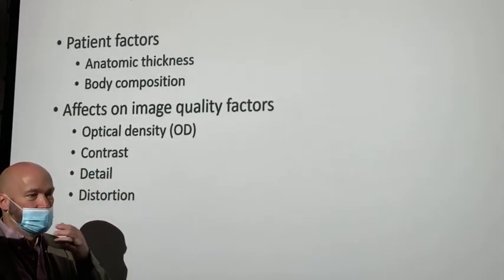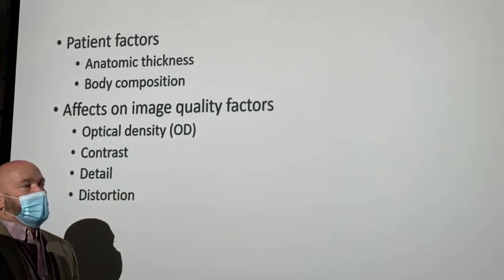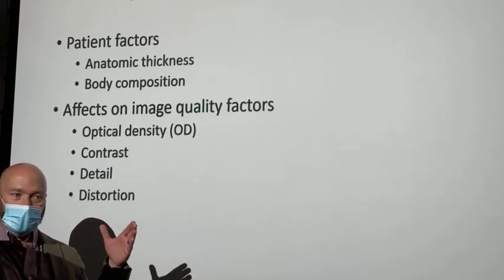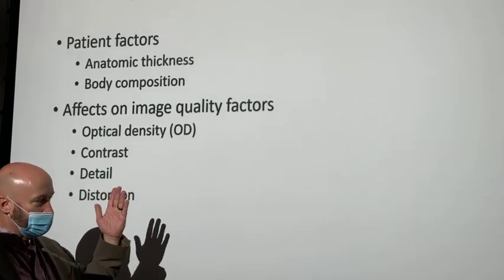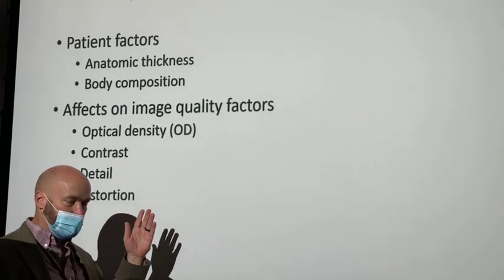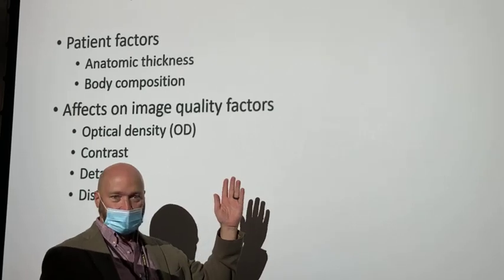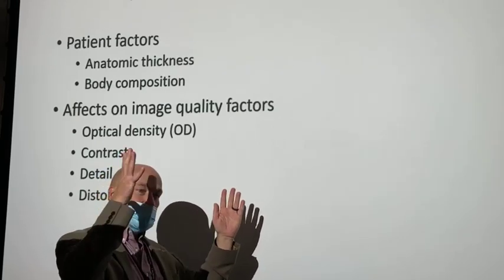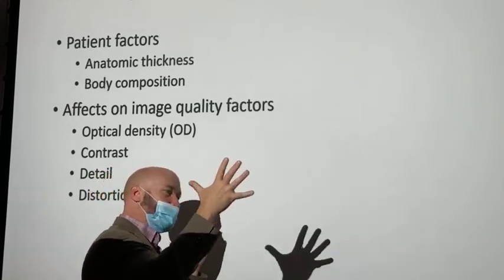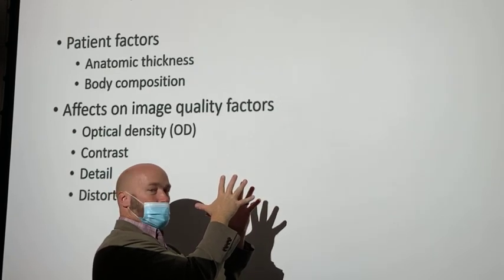And it doesn't really make any sense to you. It's just this graph of these lines. But each one of those lines represents a density at some point along the exposure, okay? So let's say that the histogram that you create whenever you make the exposure on a patient gives you a range of exposures and densities that look like this. But the stored histogram looks like this, okay? So what your computer's gonna do is it's gonna take this and compare the two, and it's gonna adjust yours to where it looks like the one that's stored in the computer.